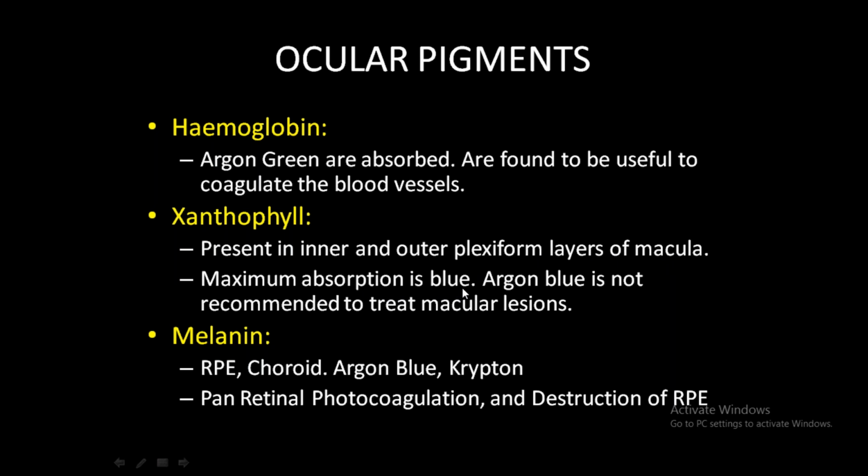Its maximum absorption is blue, and argon blue is not recommended to treat macular lesions. Although the absorption of blue laser in the macula is maximum, it has its own disastrous effect, so it is not used, because if you give laser in the macula, it can cause permanent loss of vision. Melanin is mainly present in the RPE and choroid, so for that you can use argon blue or krypton laser. In pan-retinal photocoagulation or destruction of the RPE, you can use this type of laser.